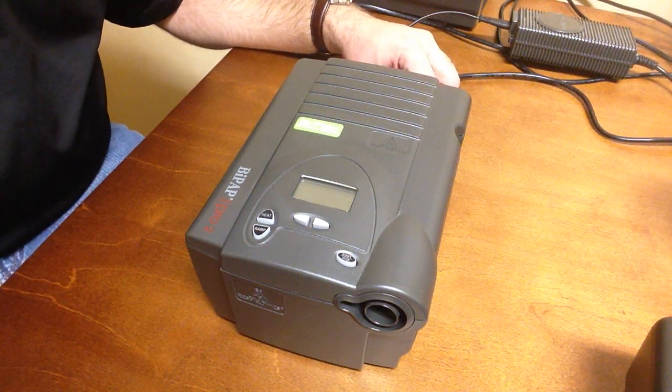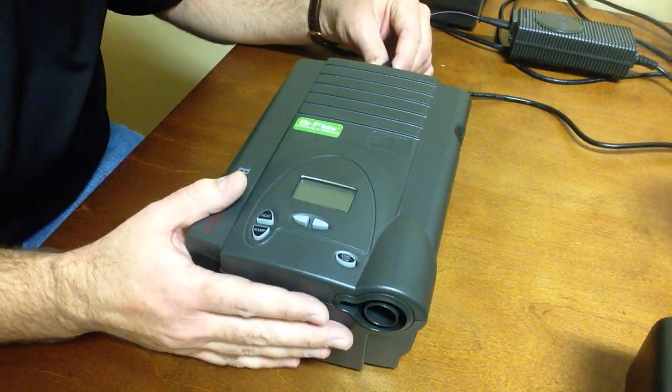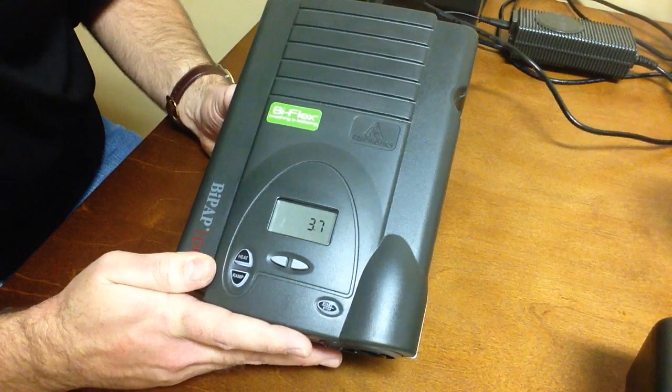To check the hours on a Respironics Legacy Series device, it will be displayed on the screen. As you plug the device in, you're going to want to watch that screen right away and either take note of those numbers or look for the highest.